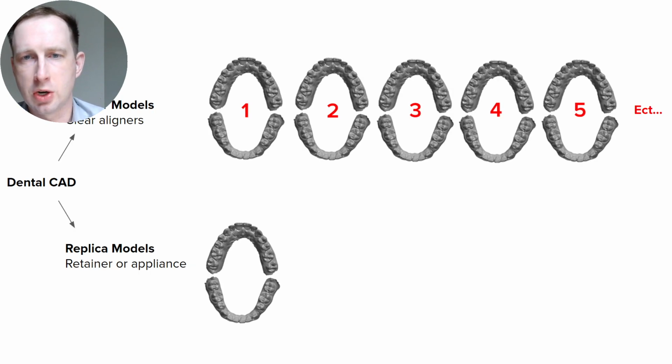And there's going to be two major groups I want to point out before getting into the real detail here. But for orthodontic appliances like thermoformed appliances, aligners, and retainers, there's really two main outputs and differences. So aligner models, it's a treatment plan. It can have many steps to it, and you're thermoforming or creating many different clear appliances during that treatment process.